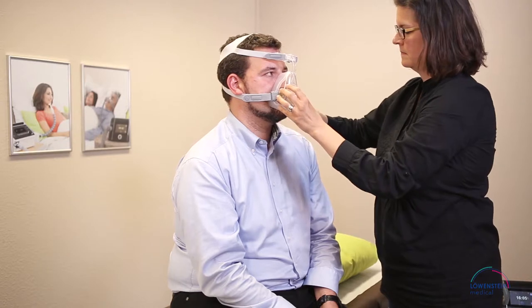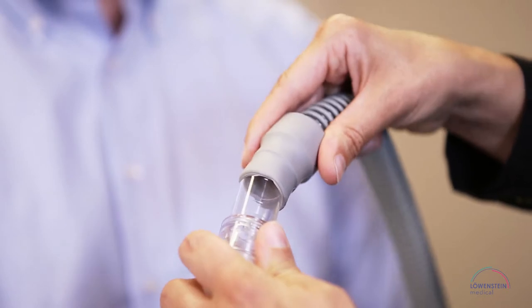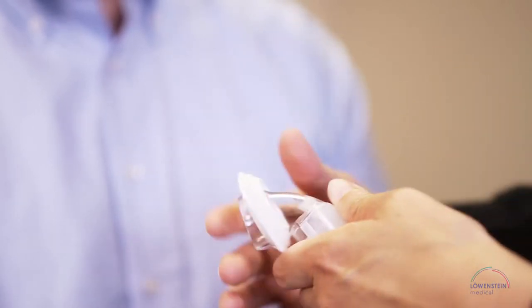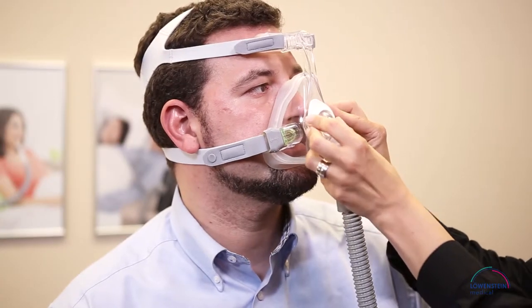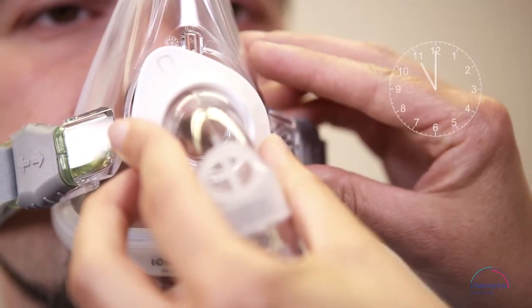Now you can look inside the mask body to check the fit of the mask. The patient can breathe more easily and speak with you if necessary. Connect the tube with the elbow, then set the tip of the retaining ring at 11 o'clock and turn it from 11 to 12 o'clock until it clicks into place.